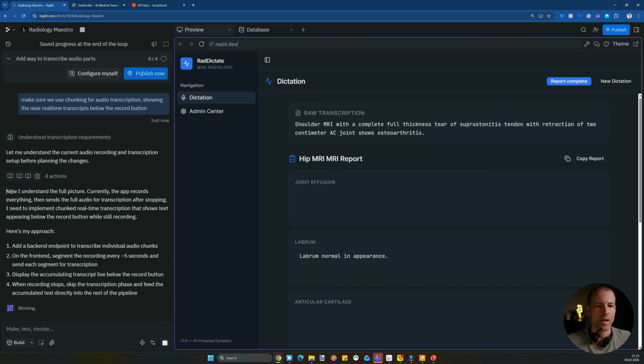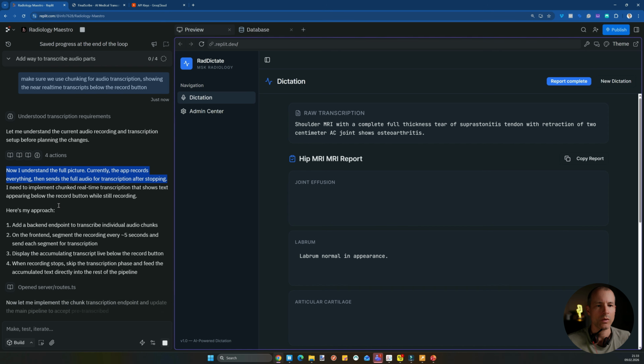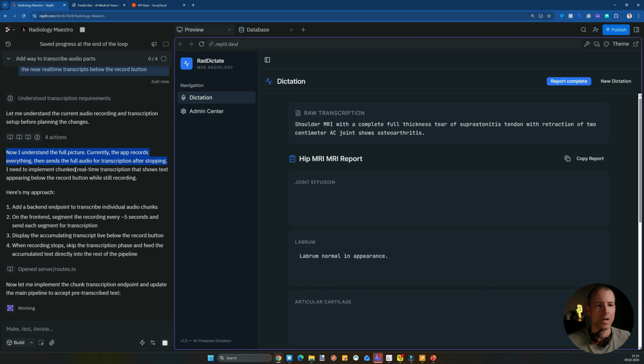Yeah, now you can see the app records everything, then sends the full audio for transcription after stopping. I need to implement a chunked real-time transcription that shows text appearing below the record button while recording. Add backend to transcribe individual audio chunks on the front-end segment, recording every 5 seconds and display. Well, I'm not sure if this is a good idea, 5 seconds.